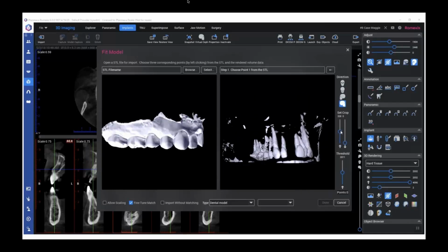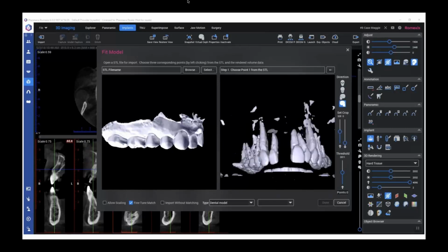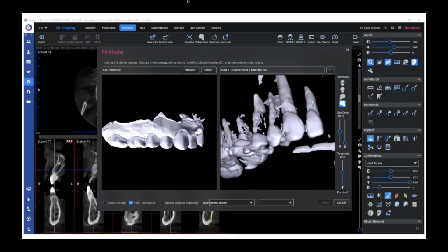So how do we do this? If you farm out your surgical guides, someone is doing this for you. The more experience I have doing this, the more I don't know that I would trust someone to do it for me.